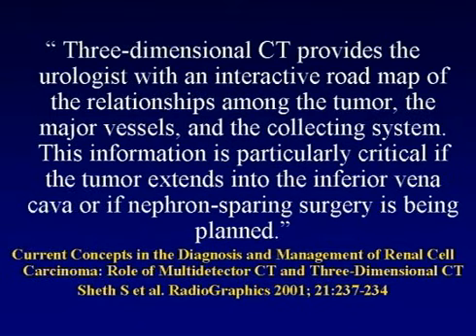We recognize the point about radiation dose to patients. I think one of the best ways of decreasing radiation dose is to do the study right the first time. And if you maximize the information from that examination, it's not an issue. The biggest danger is to end up with 3 different studies, an IVP, one CT, and then a follow-up CT for more clarification. Then you really increase the radiation dose. A single study done the right way the first time really decreases radiation dose.